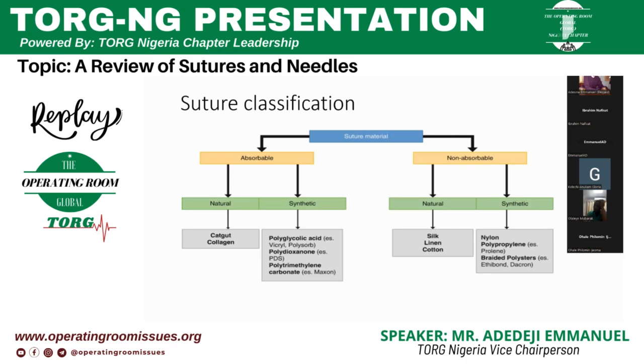The chromic catgut differs because of the addition of chromium salt, strengthening the catgut so that it can last longer. However, with the development of practice it was discovered that the longer it stays is not more an advantage, which I will discuss in the course of this presentation.